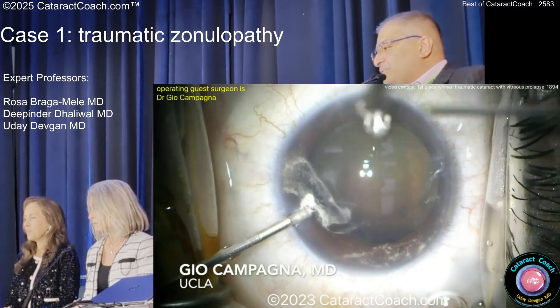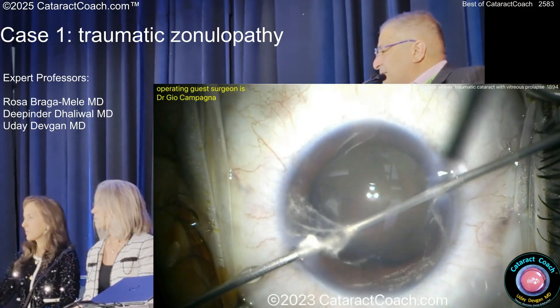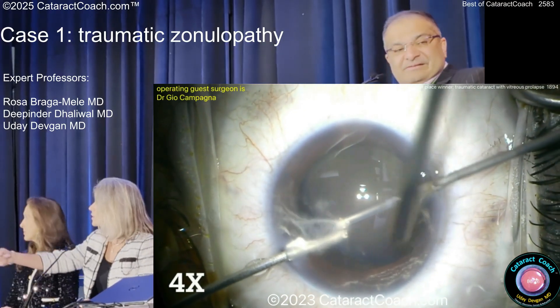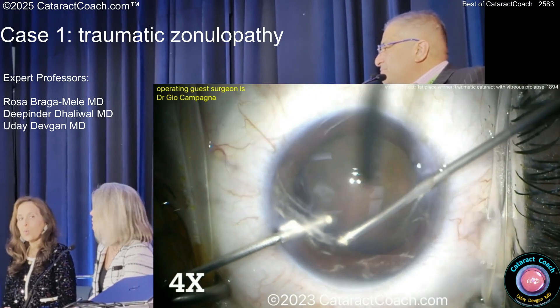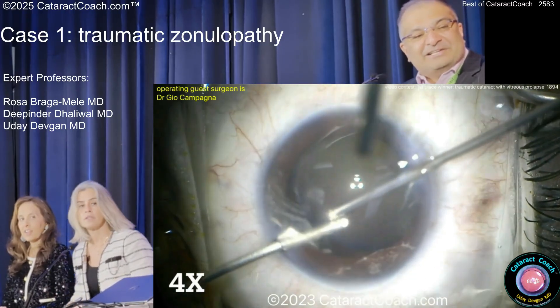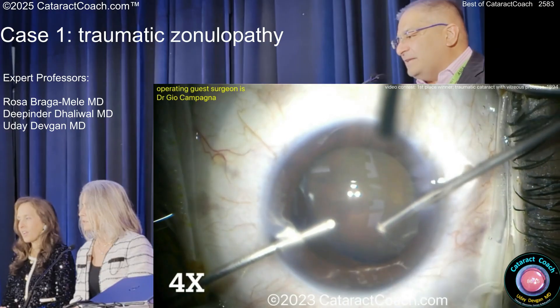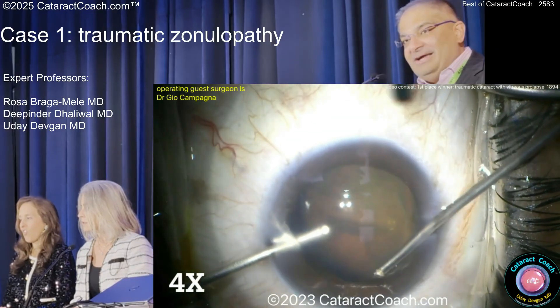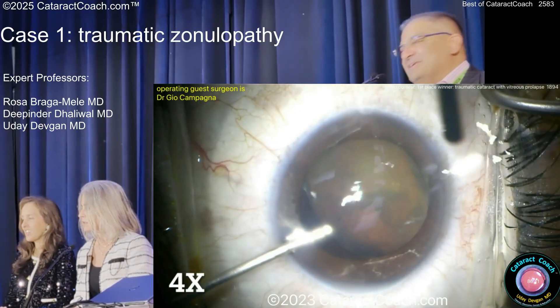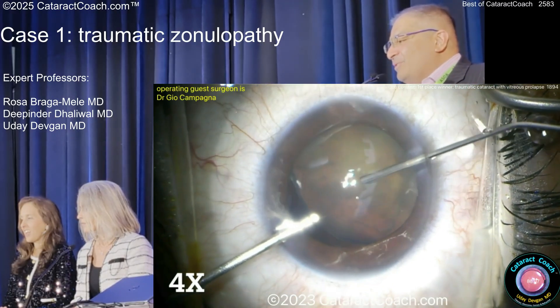So here's what we did — triamcinolone was injected here. There was a lot of vitreous! So there's a lot more vitreous than you imagined. And the other part too is it seems like the vitreous was helping to stabilize the lens. So now you're taking out the vitreous, and now the lens is getting more destabilized — now it's more stressful. There's the viscoelastic finally. There's still some vitreous around.